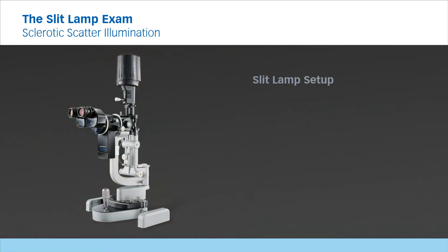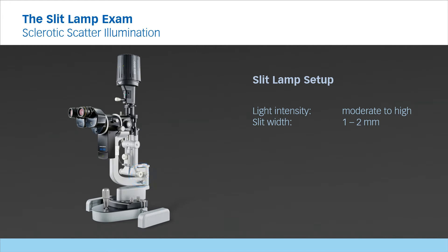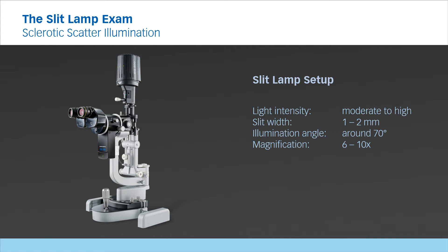To set up the slit lamp, choose a moderate to high light intensity and a slit width of 1 to 2 mm. Set the illumination angle to about 70 degrees and decouple the illumination tower. Choose a magnification of 6 to 10 times to ensure good depth of focus. For information on how to decouple the illumination tower, watch the movie Components of the Slit Lamp.